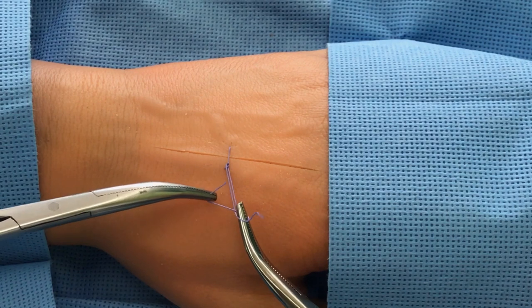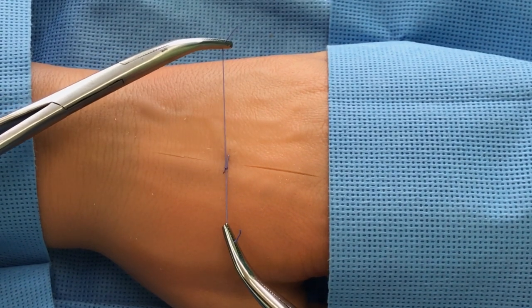The second, single loop is similarly formed and tightened.